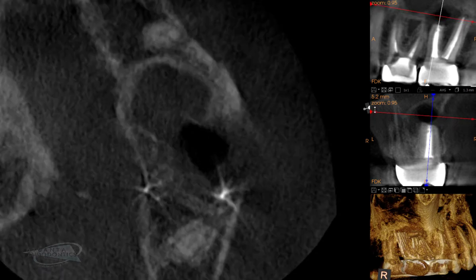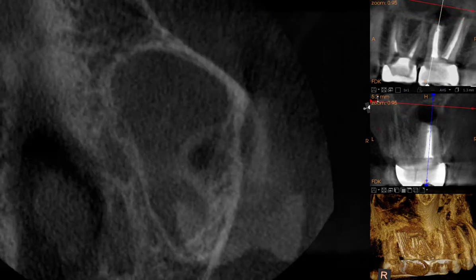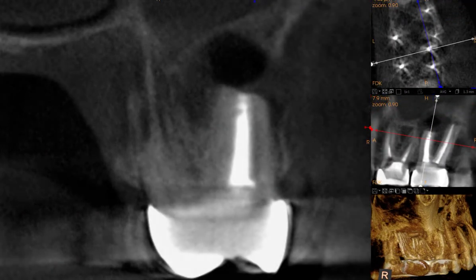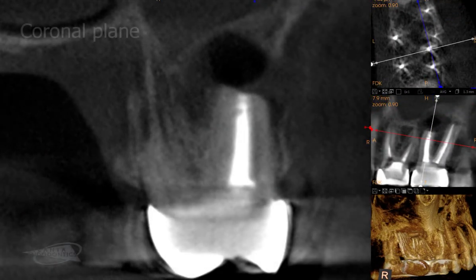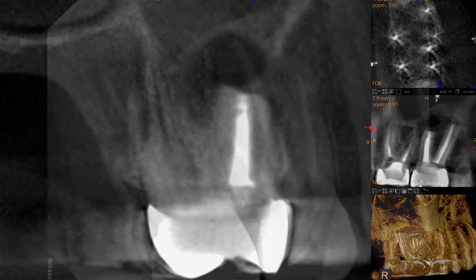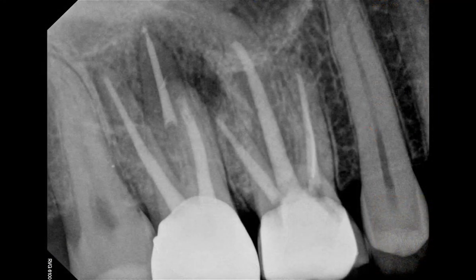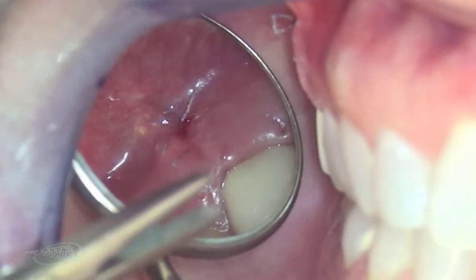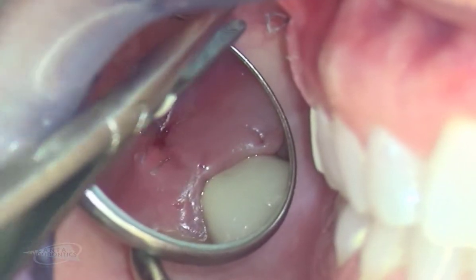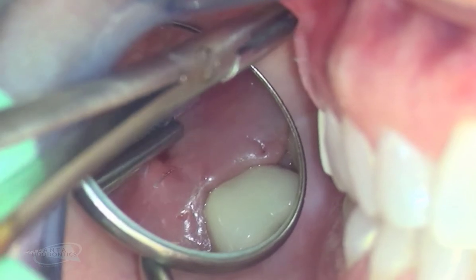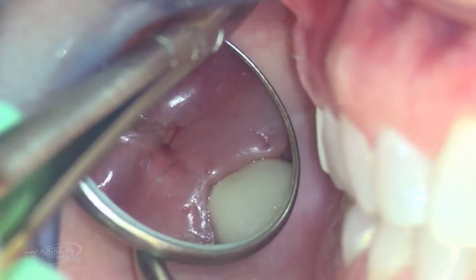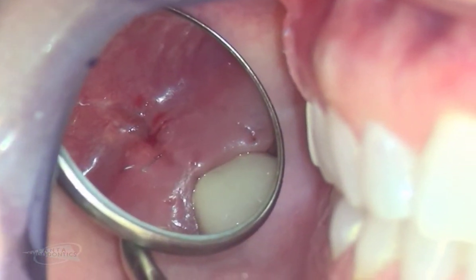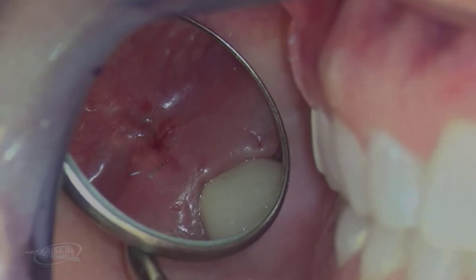Post-operative CBCT imaging shows complete apical resection and retrofilling. We can also appreciate the post-operative result in 2D. Suture removal was performed one week post-operatively with sinus tract resolution. We are looking forward to seeing the healing process continue in six months.